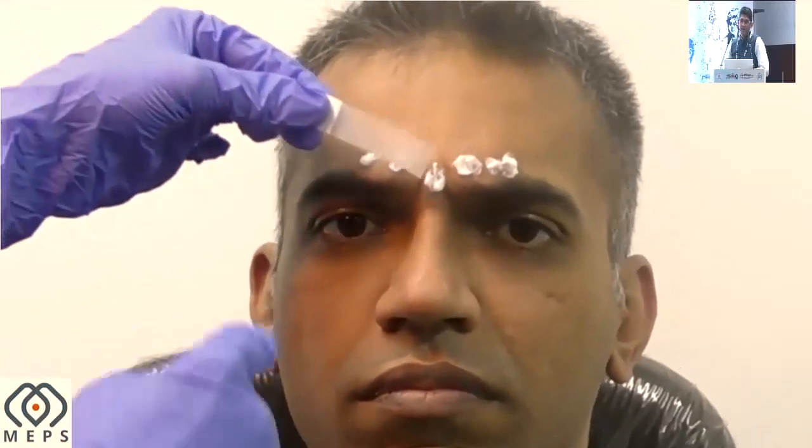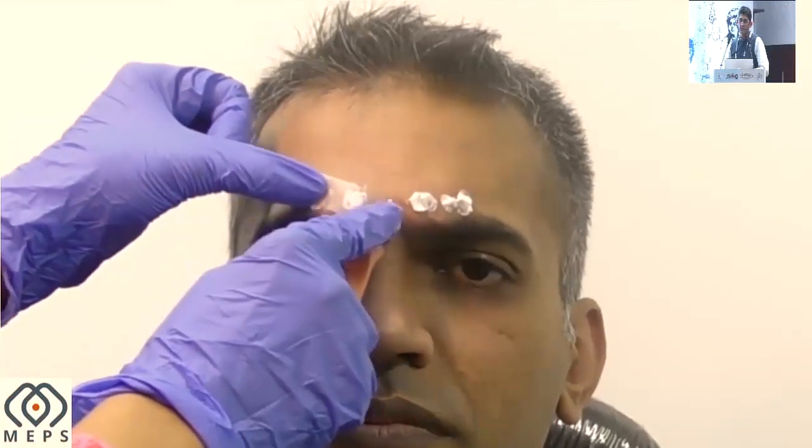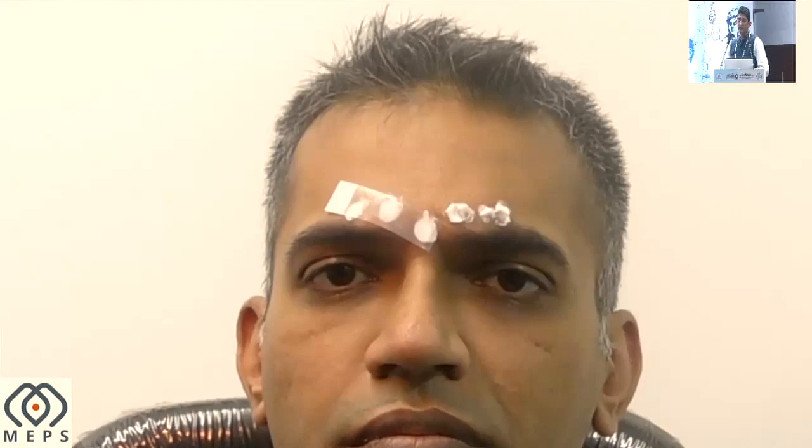So once this cream is applied, you can either spread it with a spatula or with your gloved fingers and then apply this occlusive tape which comes within the packaging of the cream. This occlusive tape usually helps in penetration, and so the wait time is less. So if you use this occlusive tape, you can inject the patient after 30 minutes. If you don't use it, you have to wait at least 45 minutes to an hour before you inject.